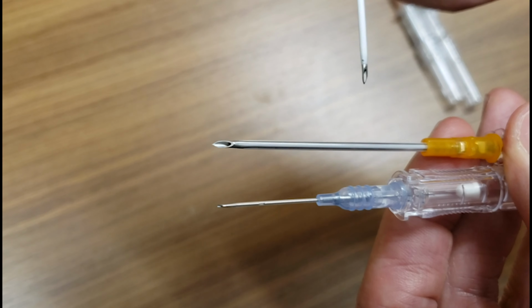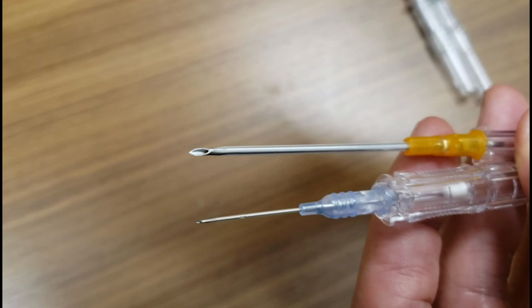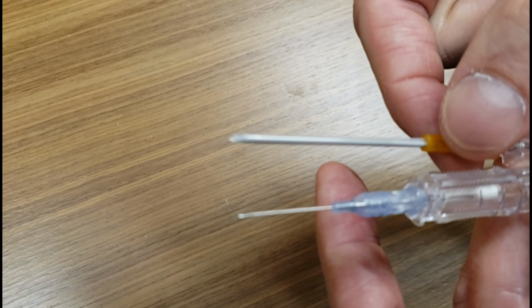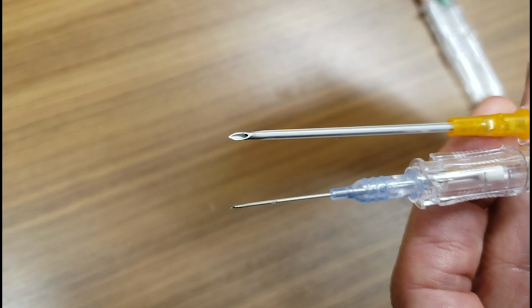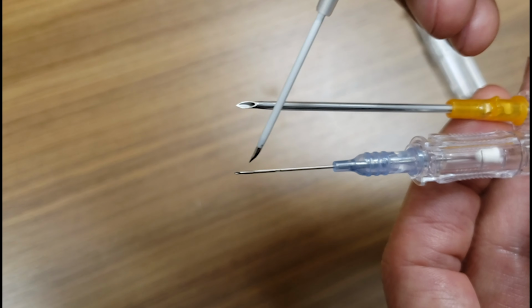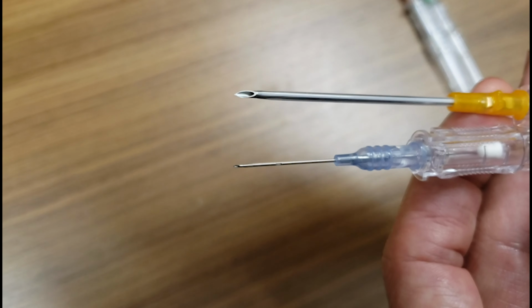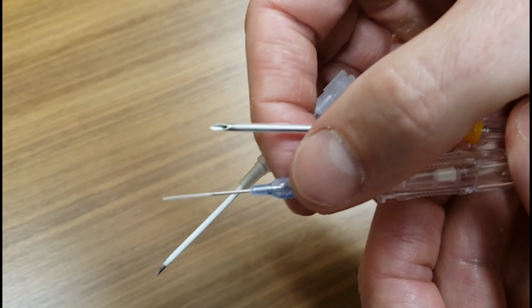But let's take the 14 for example. If I get only 1 millimeter of the bevel in, I get a flash. If I think, oh, I'm good, I'm in, and then I go to thread this catheter, what happens? The catheter goes into the soft tissues and not into the blood vessel. Why? Because the entire bevel wasn't in. So if I had a 22, when I get flash at 1 millimeter, I have to push this in 1 millimeter more. When I'm in a total of 2 millimeters, then I can thread the catheter.